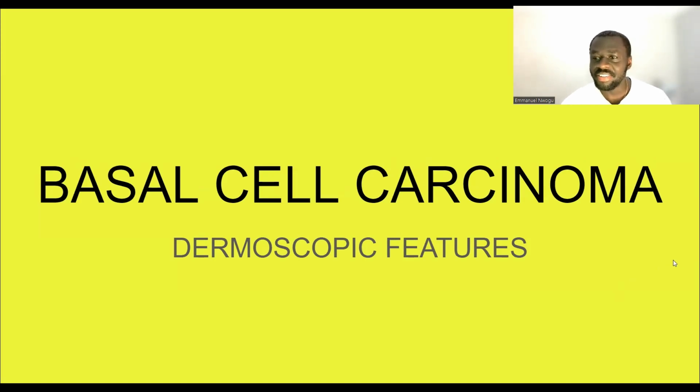Hi guys, in this video I will be showing you very quickly what a basal cell carcinoma looks like when you place a dermoscope on a lesion. When you place a dermoscope on a lesion, the question you're asking yourself is: is this lesion very likely to be benign, or is it more likely to be suspicious for a possible skin malignancy?